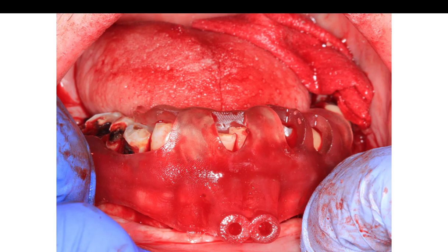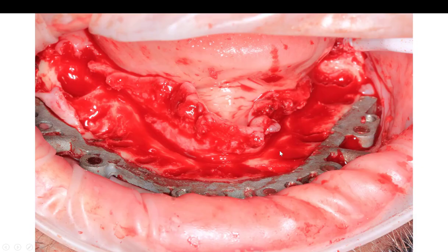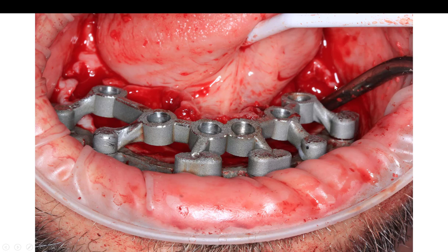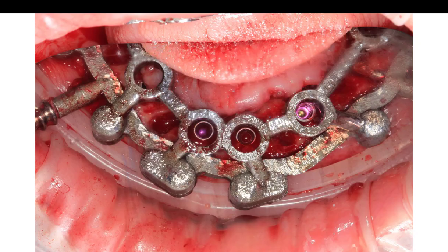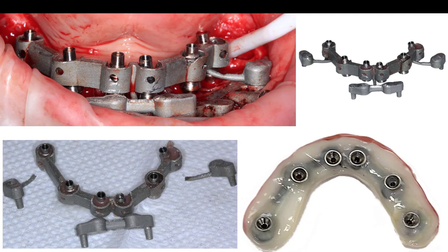I'm going to show here initially the way I traditionally have done it. So this was a recent case I helped someone with. We did a pin guide and then we followed that with the bone reduction guide which slid in along the pins and gets pinned into place. You do your bone reduction and then we would have the magnetic stackable drill guide which would pop on here. Notice how many connections I had to make here, because I've done a bit of a redesign on the attachments that have cut down on a lot of the work. But you do have to make a lot of connections between this.